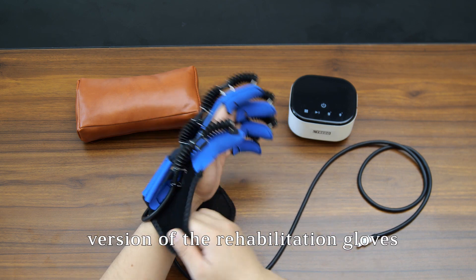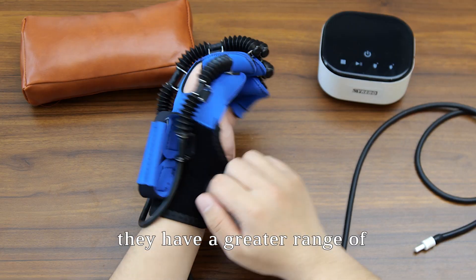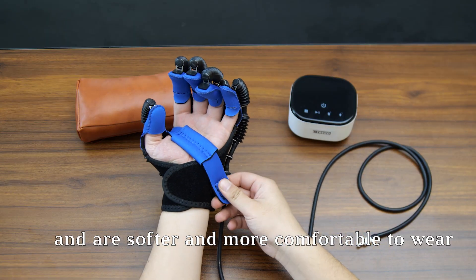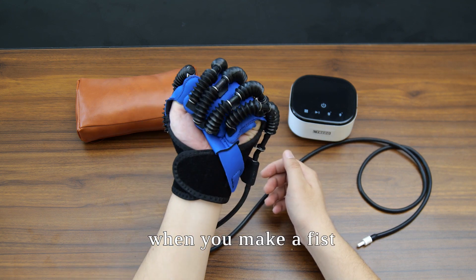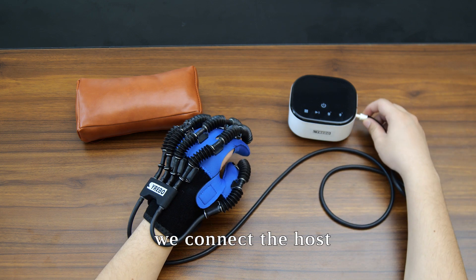First, we put on the gloves, which are the latest version of the rehabilitation gloves. Compared with other brands, they have a greater range of flexion and extension and are softer and more comfortable to wear. The velcro should fit snugly with no gap in the wrist when you make a fist.